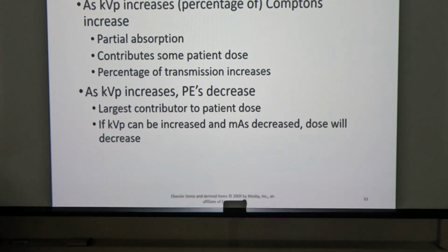But just understand that what the question is really asking you in the context of the question is, as kVp goes up, the penetrated scatter photons increase much more, and therefore your image is dominated more by Compton than by penetration and photoelectric absorption. And that's what we refer to as the PE ratio. All right, so as kVp goes up, Comptons go up, and the context of that is they go up and emit from the patient and strike the image receptor.